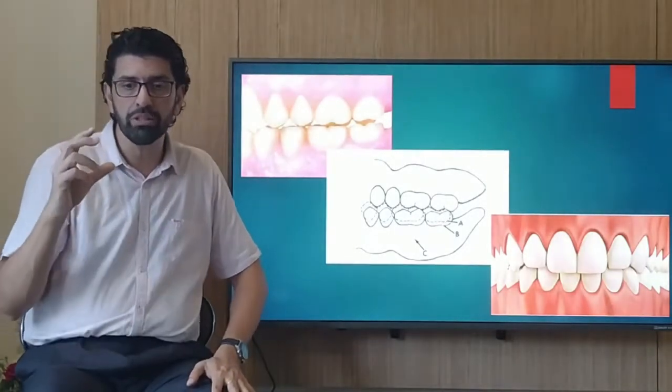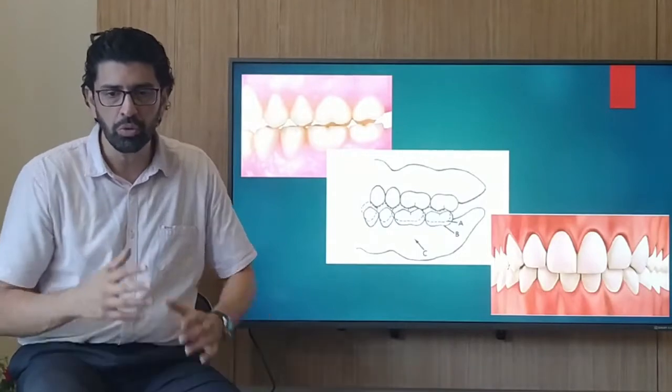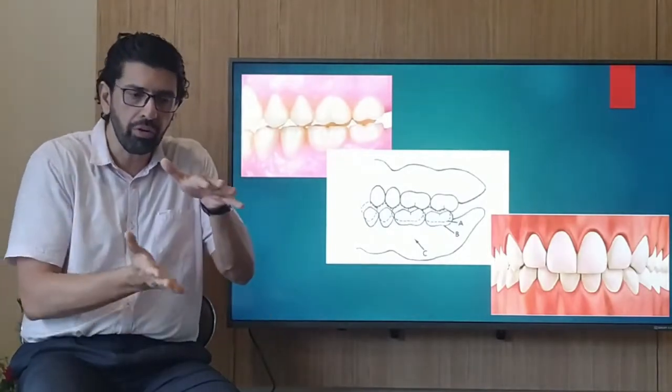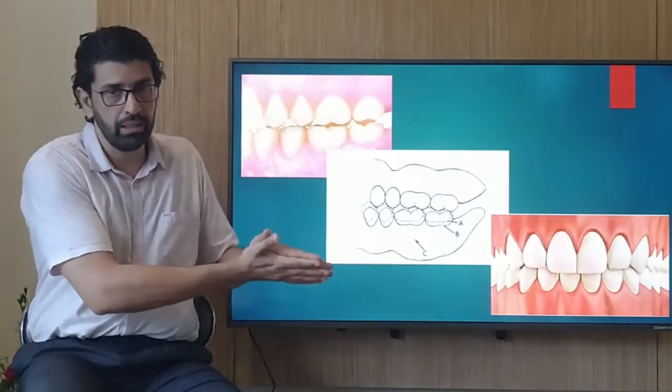The amount of this error will be magnified when the inclined planes contact. So for this reason, you need to check that all teeth have uniform contact at the same time in the mouth, like in the articulator.